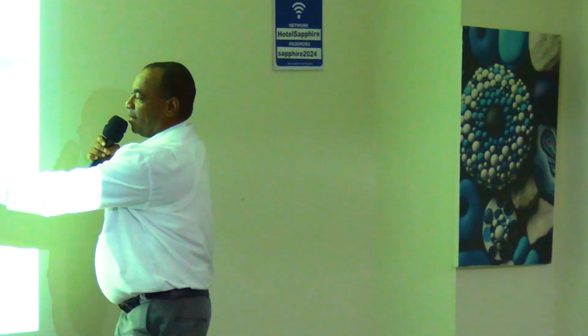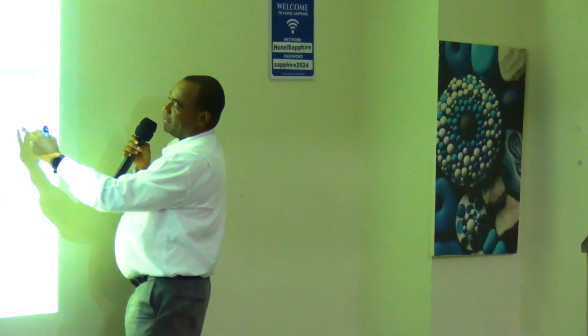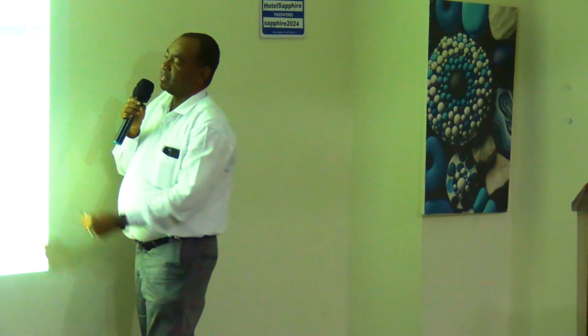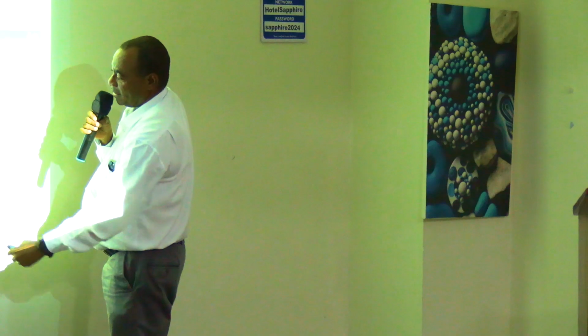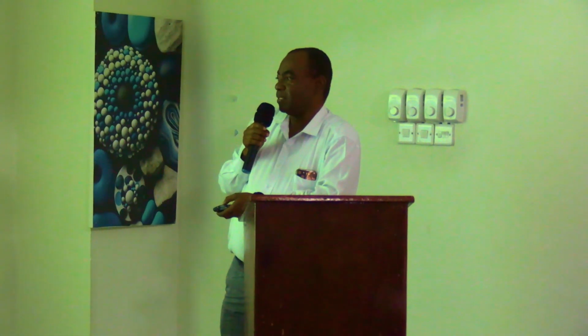So how do we do it? We follow this method, and it's also in our user manual. So this is how we do it. From our main menu, we click on QC test. Once we click on the QC test, we get the second screen. So we click on the system check. Once we click on system check, this is what you get. At this point, we insert the ID chip, and we insert the cartridge, and we click start. Then the machine will give us a result. So that is the simple procedure of the system check.